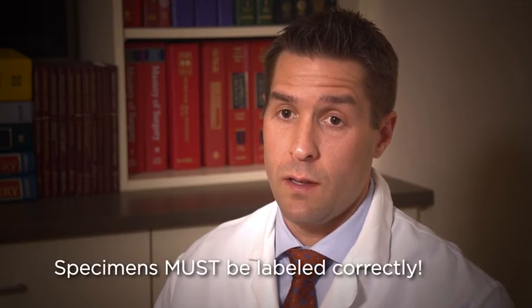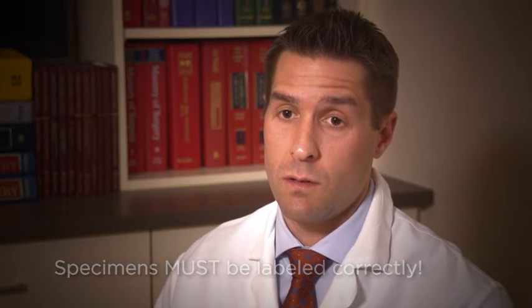Again, please make sure that your container is labeled appropriately with your name, date of birth, start and end times of the collection. Unfortunately, we cannot accept unlabeled specimens because it can lead to errors in patient identification.